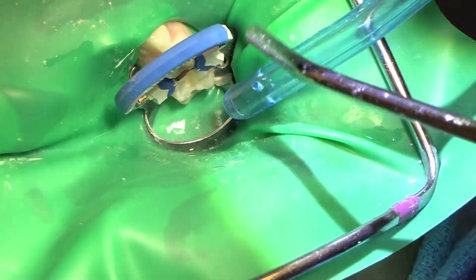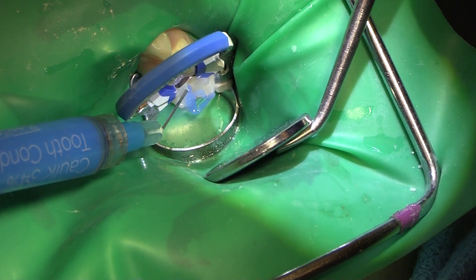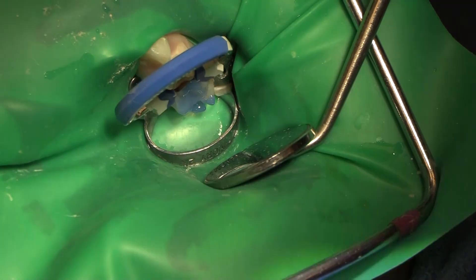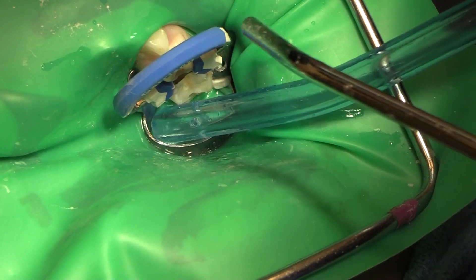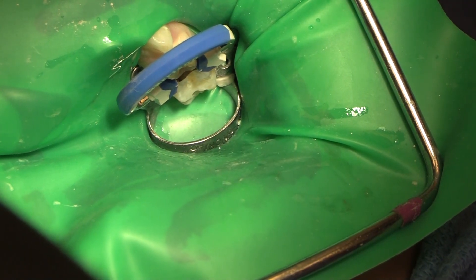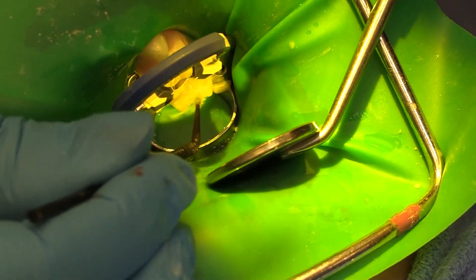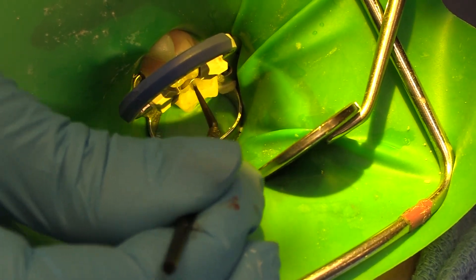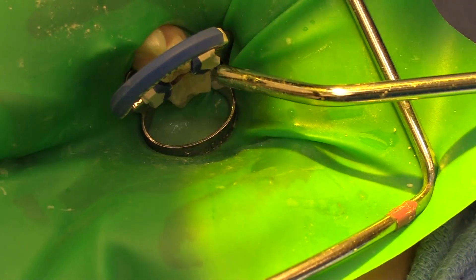Now we're going to etch and bond and put in our composite. A little bit of etch around the occlusal here — this is a selective etch technique where I'm just etching the enamel. If it drips onto the dentin, I'm not concerned. I'm going to use a universal bond so it can work in any situation, whether total etch or self-etch mode — it's really quite dummy proof. Flipping down our light so we don't cure it before we're ready, and making sure that your brush is small enough to get down to the base of that restoration. If you can't get your brush down there, you're not getting any bond down there, and you're going to have a failed restoration. Then I'll cure that.